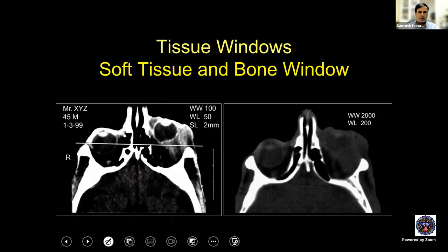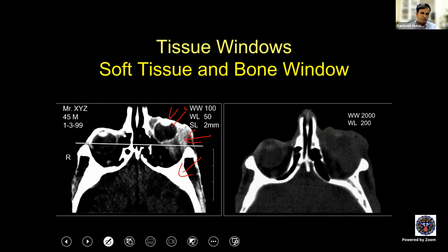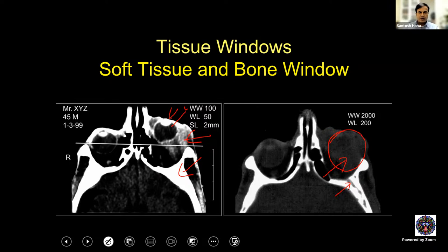You also ask for tissue window — soft tissue window and bone window as appropriate. In soft tissue window, you see the entire eye, the lens very clearly, and the tumor in all hues of gray, whereas bone appears pearly white. In bone window, you see the internal architecture of the bone very vividly. The importance is that if you don't have access to MRI and have a patient with adenoid cystic carcinoma of the lacrimal gland, getting both windows gives you enough information to even operate on that patient without needing MRI.